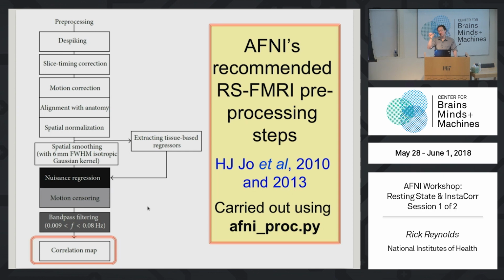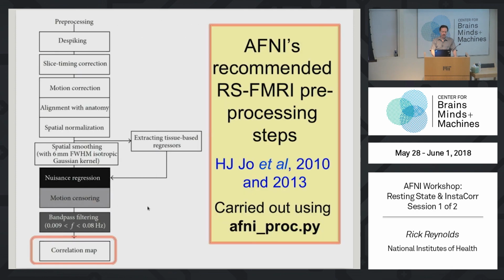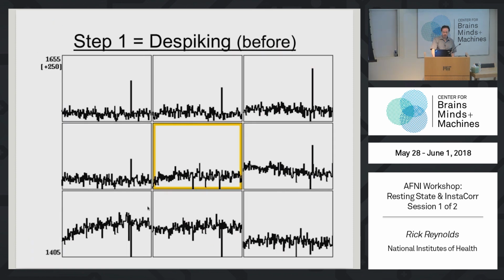So for example, tissues that we do go after, we might use ANATICOR to go after local white matter. I'll get to that. Is that soon? Let me just run through these and then I'll see what's in the slide, because I don't quite remember everything in here. And then we'll mention some of the details as we go.